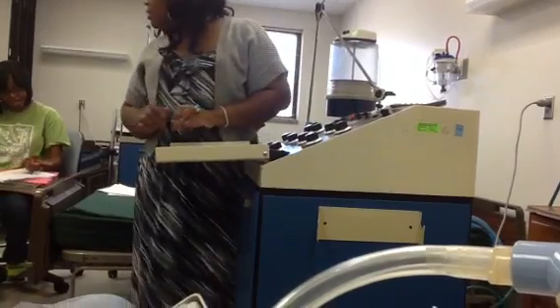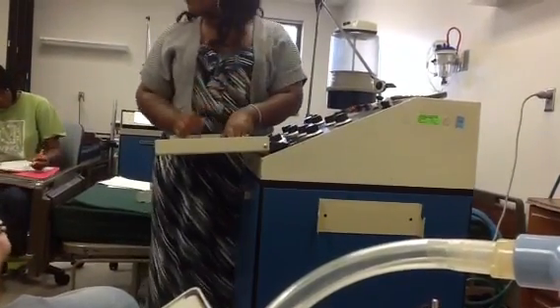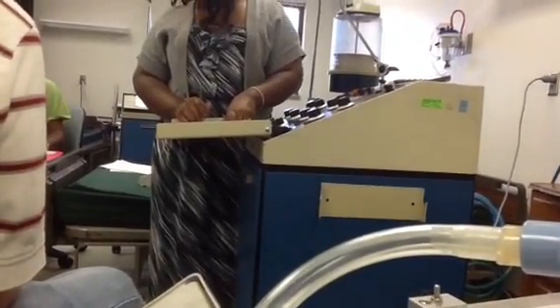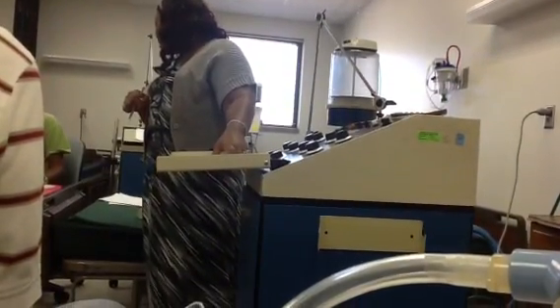Alright, what's the next one? Sigh rate. Alright, we set that. It was 6 by 3. So 6 times 3? Just the symbol, times symbol. So 6 by 3.